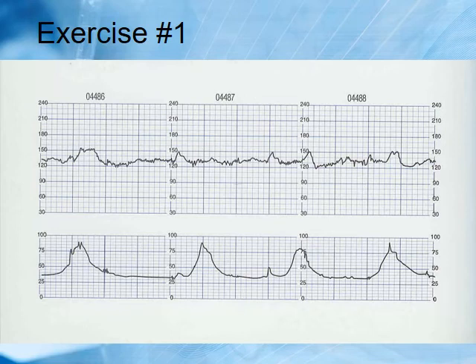Okay, let me show you what I would get. If you do peak to peak, you got one here and one here. So peak to peak would be 1, 2, 3, 3.5 minutes. This peak to this peak is 1, 2, 3 minutes. So 3 to 3.5 minutes.